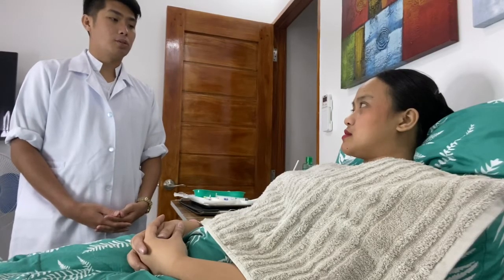Perform hand hygiene and observe appropriate infection control procedures. Rationale: this prevents the transmission of microorganisms. Ma'am, I'll just perform hand hygiene before we start the procedure. Okay.